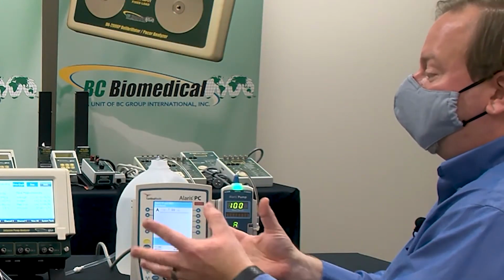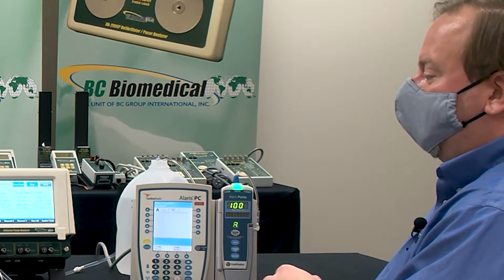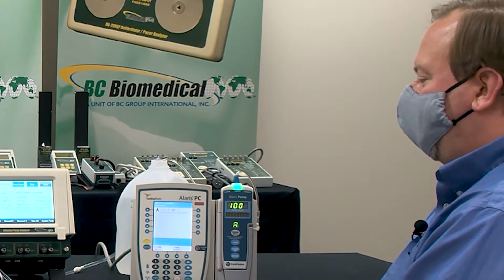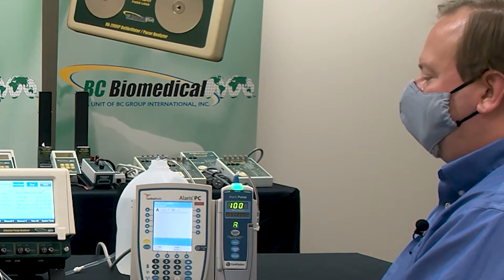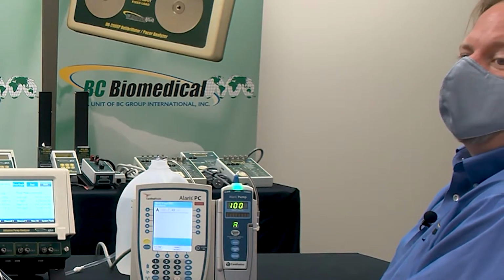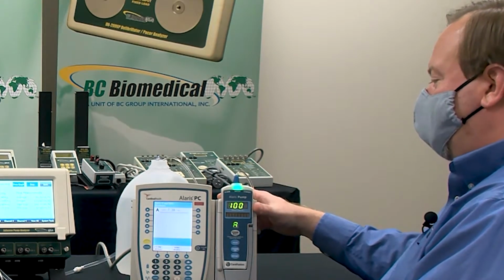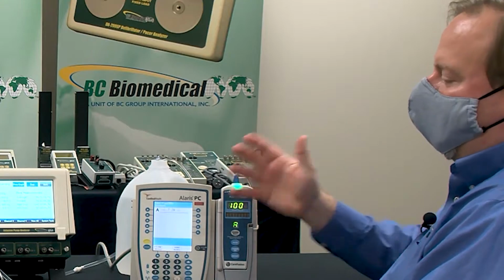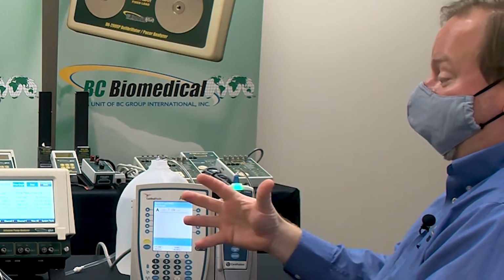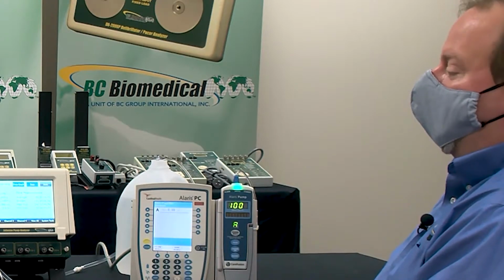So that's the difference between the automatic start and manual start, and all of the settings: all my tolerances, the air flow rates, when do I end the test, how do I start the test. And in this case, because I told it to display grams, the service manual says you have to measure grams. Well, we can't measure grams, but we can do the conversion. We're measuring volume to a pretty good accuracy, and we can convert that using the density that's in there and tell you how many grams that would be.